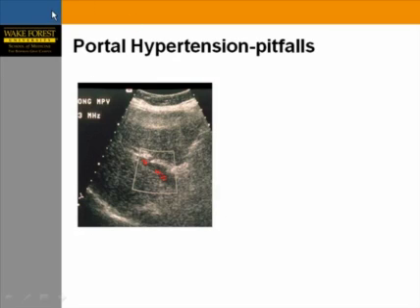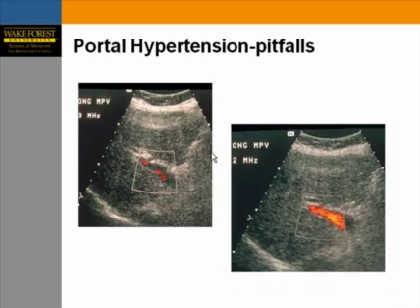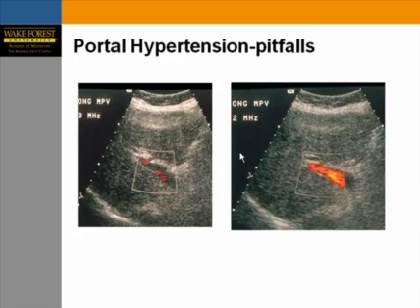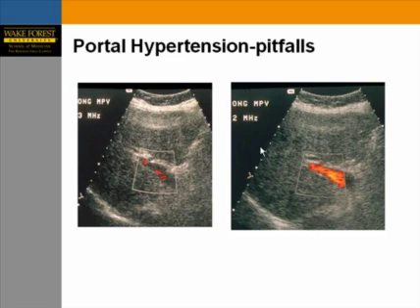An example of a pitfall: at 3 MHz, there is little blood flow visible in the portal vein, raising suspicion for portal venous thrombosis. Switching to 2 MHz fills the vein with a nice color signal, avoiding a false diagnosis of portal vein thrombosis.